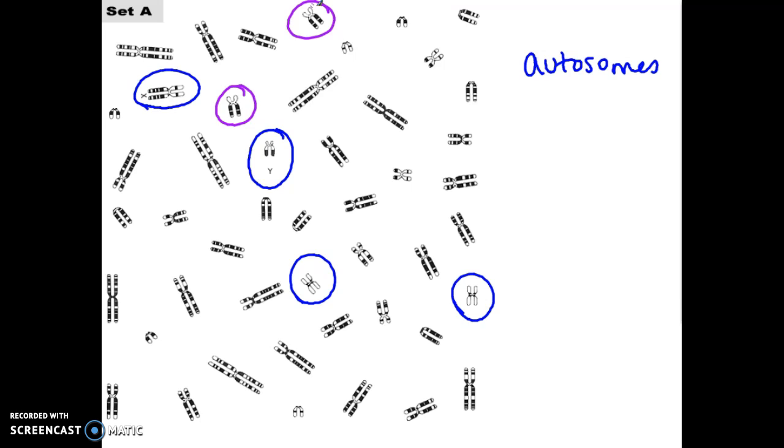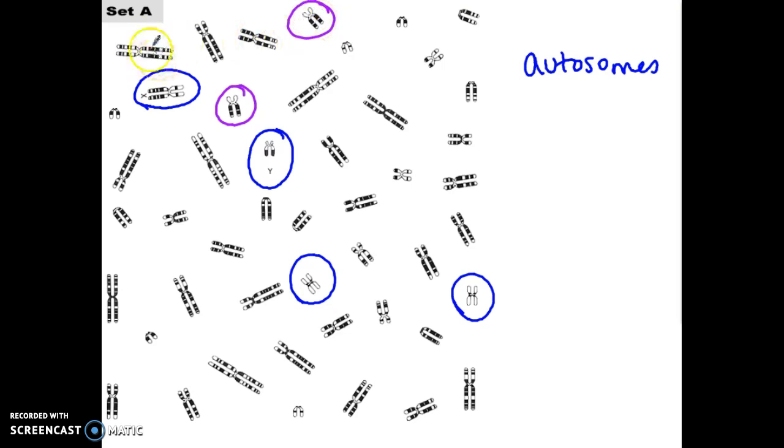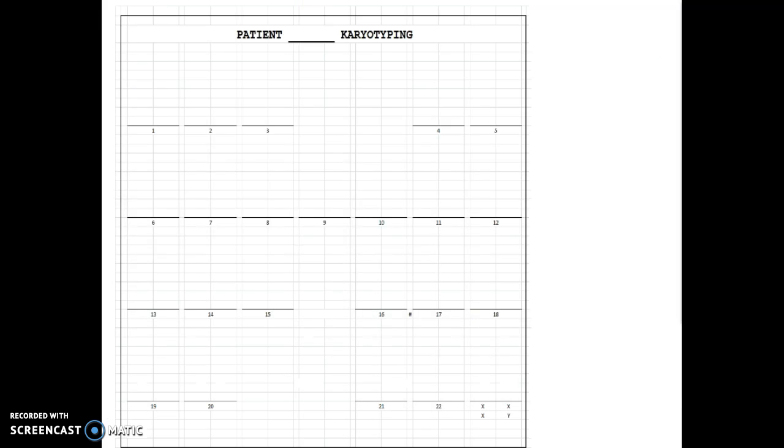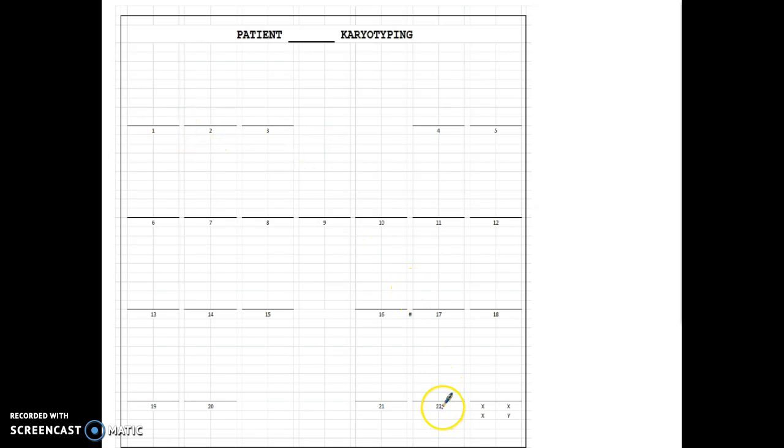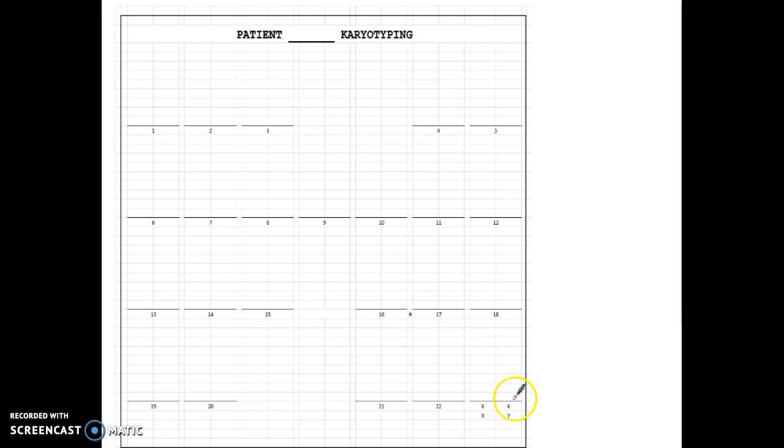And what you start to do is to organize these onto an actual karyotype, you put them in size order. So the largest chromosomes, which you will identify, this is a pretty large chromosome compared to the one that I circled in purple. So this is going to be further in the karyotype in a lower number. So here's the form that might be a typical form you fill out. So they are numbered one, two, three. It goes all the way down to 22. That represents all the autosomes in that somatic cell. Then there's a line for either two X's or an X and a Y.